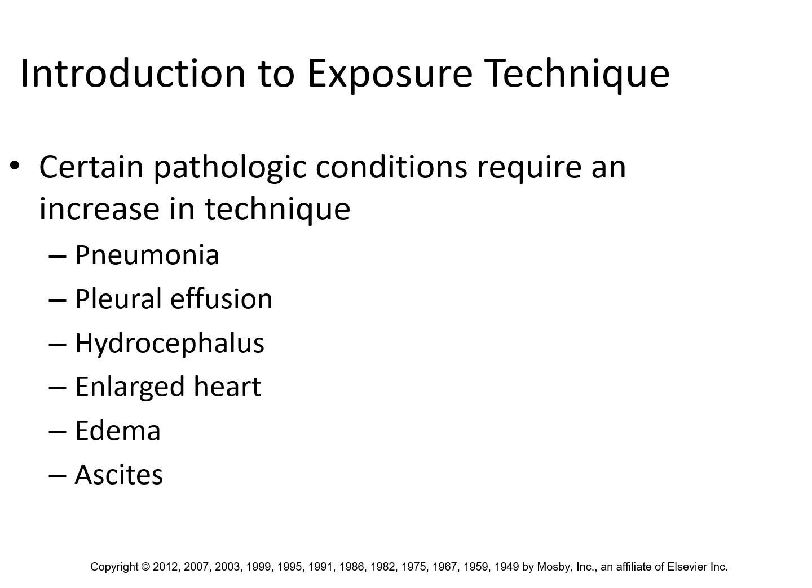So when fluid rushes into tissue, that fluid absorbs more x-rays than if the tissue didn't have swelling and inflammation going on. All of these draw fluid to the tissue that normally wouldn't have that volume of fluid, and so that fluid absorbs extra x-rays. And so you need to increase penetration power when you're dealing with these types of situations. So increase kV.